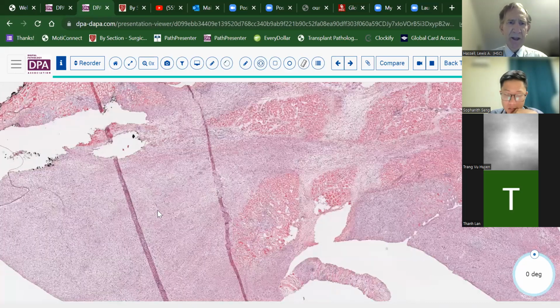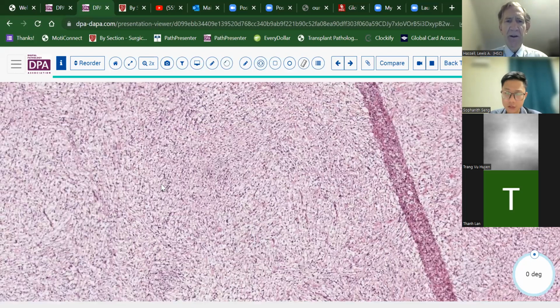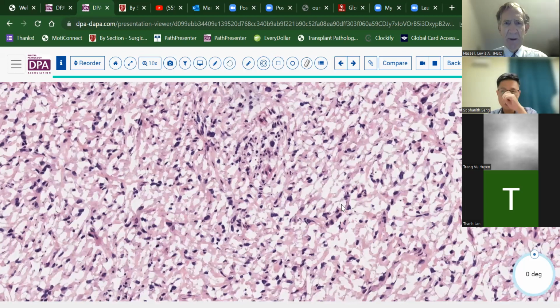So this is a tumor, and in this case, we probably had the benefit of knowing beforehand what the tumor was because they probably biopsied it. So we don't really have so much to make the diagnosis on frozen section, which might be rather difficult. We can see that there's sort of a spindle and stellate pattern of cells. There's a moderate degree of atypia through this. But aside from saying that this is likely a sarcoma, we would have a difficult time fully classifying it on frozen section. But this was known previously to be an undifferentiated pleomorphic sarcoma.